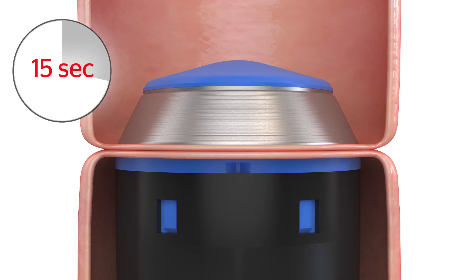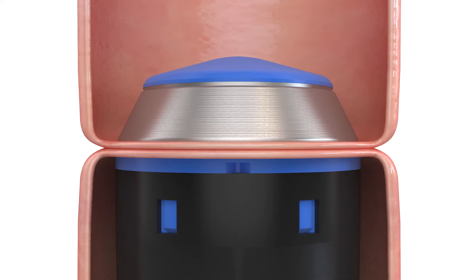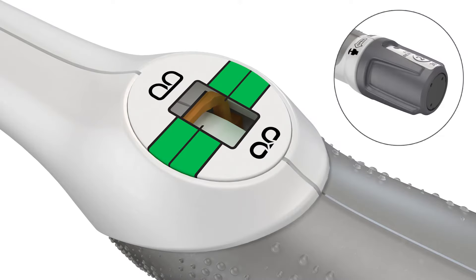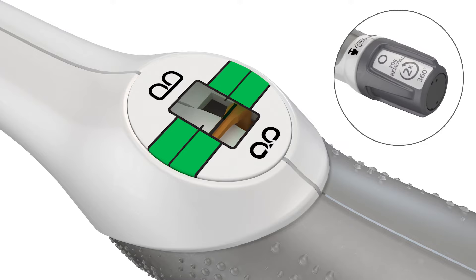Wait 15 seconds to allow for adequate tissue compression and adjust if needed to maintain appropriate tissue resistance. Once the device is fully closed and you are satisfied with the compression applied to the tissue, check the tissue compression scale to confirm that the orange staple height indicator is within the green range.